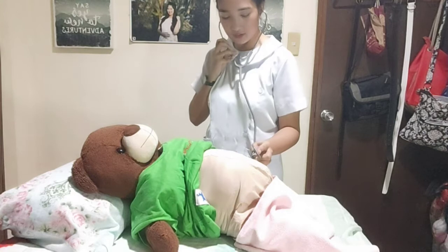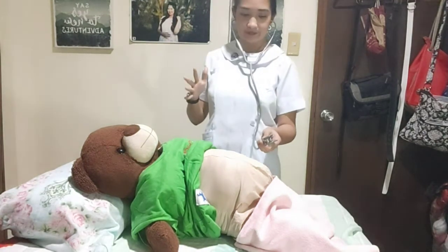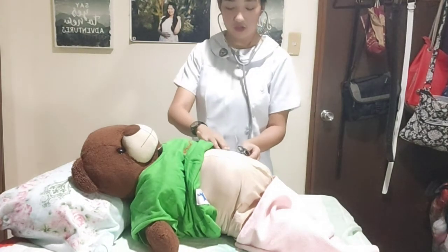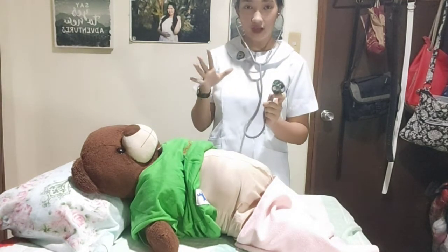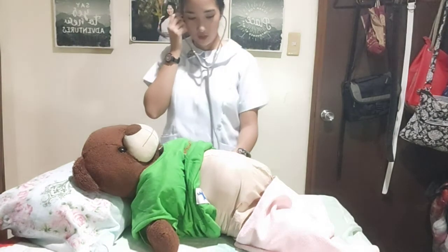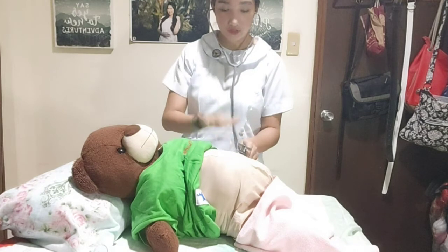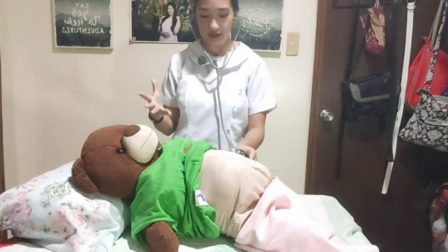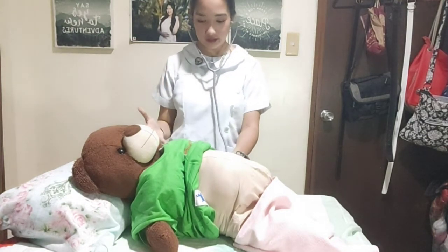So here, this is necessary to observe the rhythm in the pulse. We will just use the bell for low frequency sounds like the heart sound, and you will observe the proper technique of placing fingers on the stethoscope, as we learned in the vital signs. So we will just hear it, auscultate it.